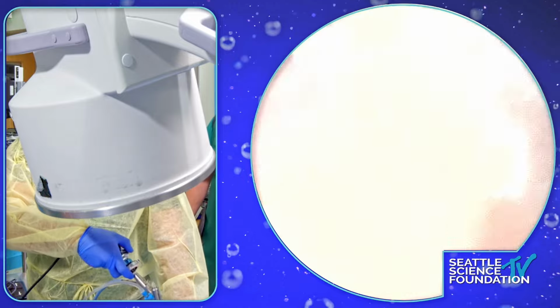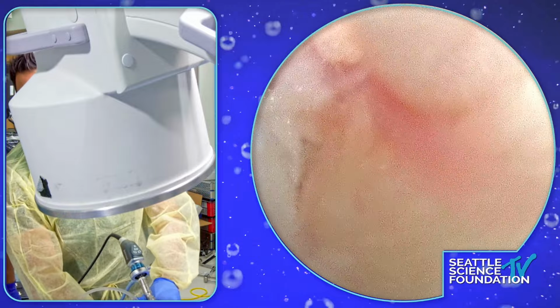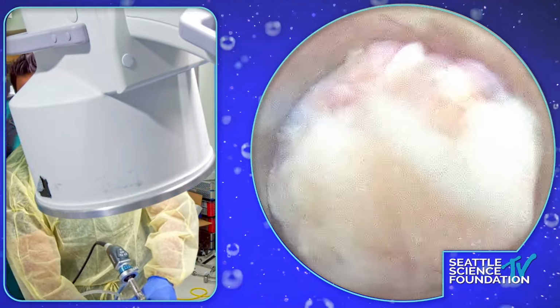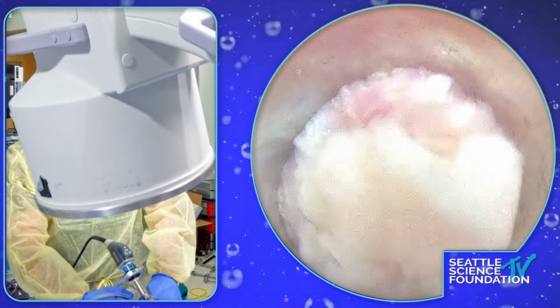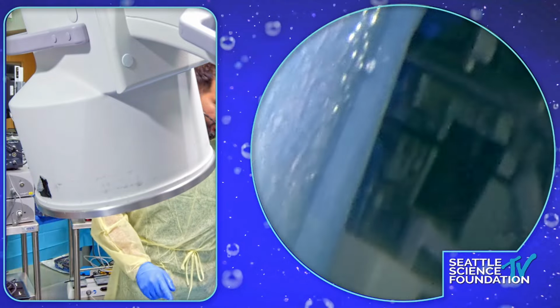So we're gonna put that down, and then we should see some bone right here, and we're gonna let the guys talk about soft tissue dissection, but if I just take a little bit of pituitary right there, you're gonna see bone right now. So let's leave some of that for them to talk about. Sure. Yeah, but we believe you that you did the targeting. Okay, perfect. Thank you.